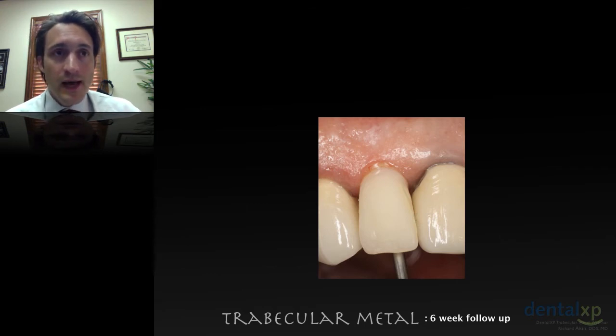He's ready to get the final on. He doesn't want to have to be worried about temporary breakage. I always tell patients that they need to be concerned about that, especially during the first few weeks after the implant's placed. Most importantly, the second 2 weeks, I tell them, is the most important time to be very careful, because as we know, with implants, the first 2 weeks, things are fairly solid. We have about 2 weeks where we have a significant drop in implant stability, maybe not clinically significant, but I tell patients to be careful.